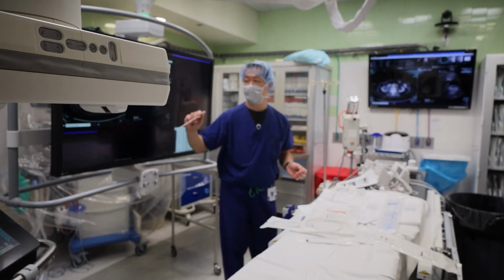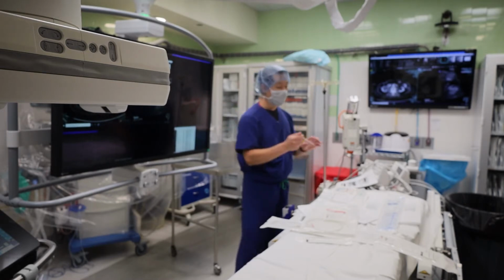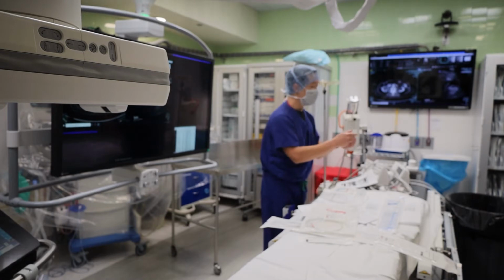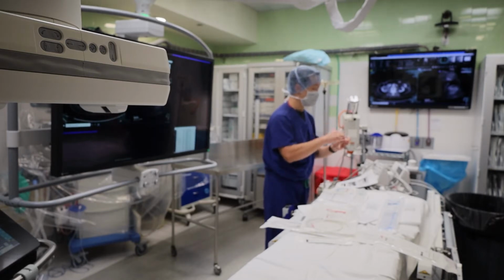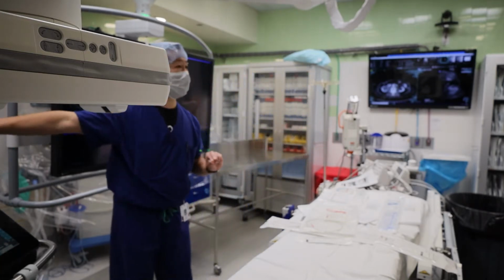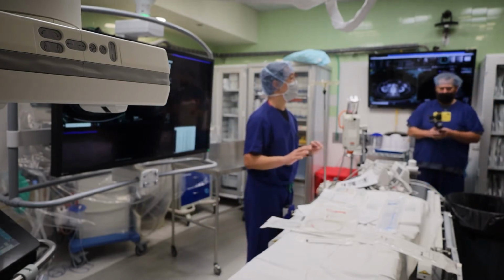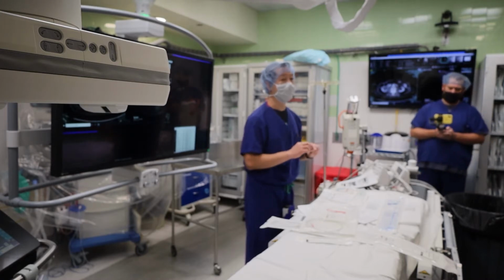So you're sticking under ultrasound, and especially for really difficult cases like the PCNL I'm going to show next. Every time you stick under ultrasound, when you remove this, air goes in. So sometimes if you're not sure where you are, we hook up a syringe of contrast and we inject. That's why we're super careful about air, and oftentimes we do a wet-to-wet seal when we hook up our tubing. We pull this out, make sure it's covered with saline, and then we hook up, because once you inject air, as we've shown, air, like in bowel, completely obscures everything, and when you have air in the collecting system, your case is over. That's a complete no-no.